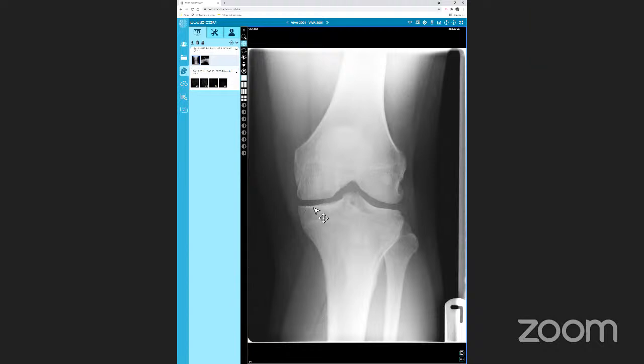Okay, so the other abnormality that I can see is within the medial femoral condyle. There's an area of low attenuation, or just overlight, there, which is the usual place for osteochondral defects. With a patient who's got a locking sensation, I'd be worried that the osteochondral defect is dislodged somewhere within the knee joint. So in my normal practice, I would discuss this with the referrer and ask them to make an orthopedic referral. They may want further imaging to ascertain where the actual bony fragment is, because I can't see it on this radiograph.